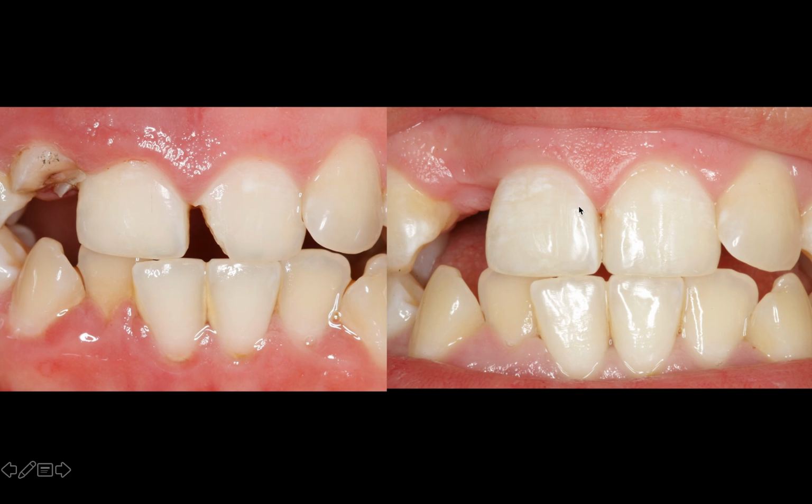So I think the symmetry here looks really sharp. We know we have a line angle here, and that's where we want light to reflect off of the mesial line angle. And we have almost that exactly. Here we have maybe a little bit larger of an incisal abrasion than I would have liked, but really looking at the symmetry, I think it looked pretty good actually.